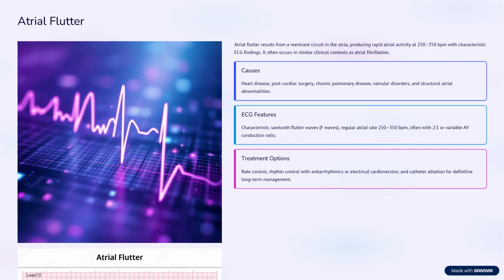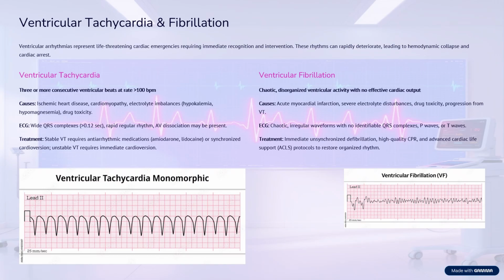Treatments aim to control the ventricular rate using beta blockers or calcium channel blockers, restore sinus rhythm through cardioversion, and prevent recurrence of thromboembolism with anticoagulation therapy when indicated. Recognizing this distinct picket fence pattern on ECG is key. Once you see it, you'll never forget it.